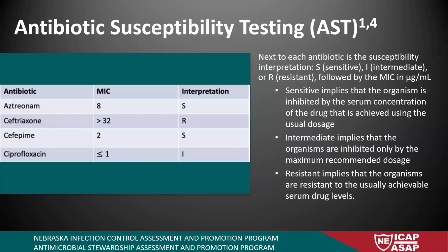A lot of facilities have a process to do that for your pre-op patients, if someone's going for surgery, so they know what kind of pre-op antibiotics to give them. Usually if somebody has more of an active infection, you'll see a whole culture report that has the susceptibility testing, which might hint to you that that's more of an active infection, depending on the patient's symptoms. It could be colonization too, but again, you need to look at the whole clinical picture, but that would be more likely to detect an active infection.